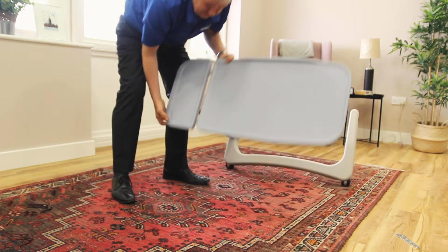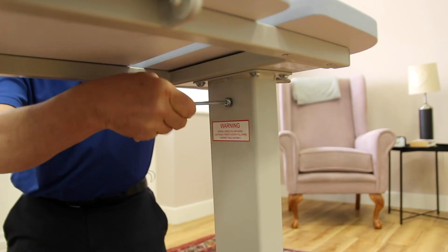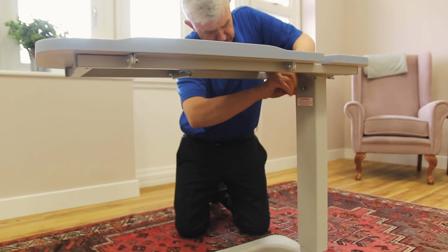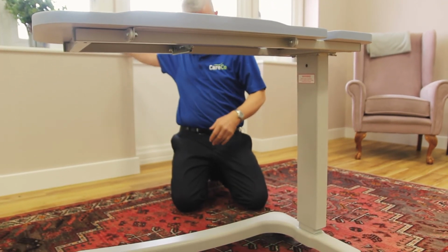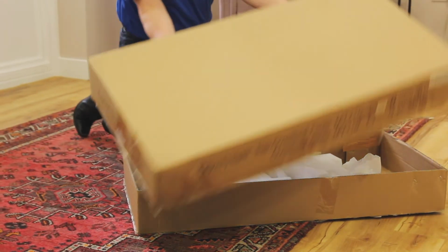Flip the table back into an upright position, now resting on the caster wheels. Remove the bolt on the side of the post to release the height adjustment feature. We strongly advise that you do not remove this bolt until you have completed all the other stages of assembly. Your CareCo item is ready for use.